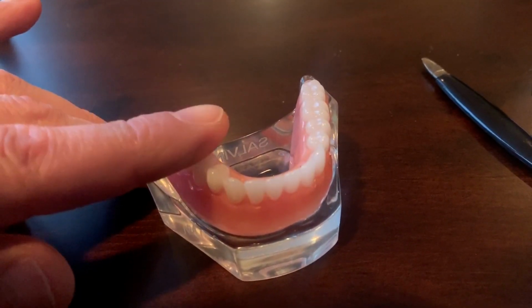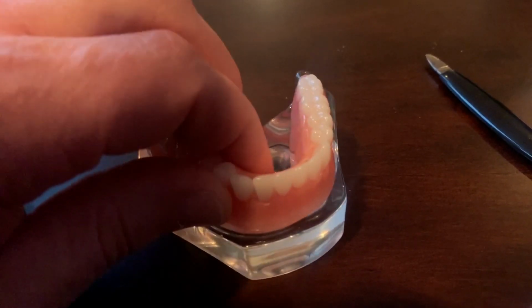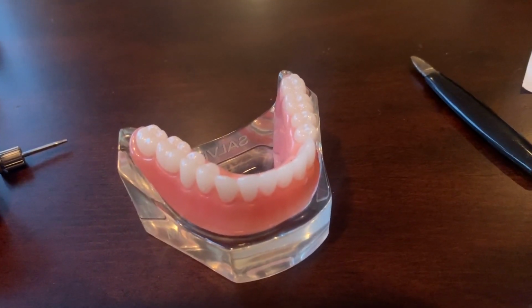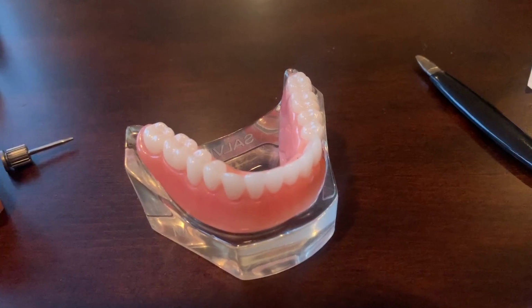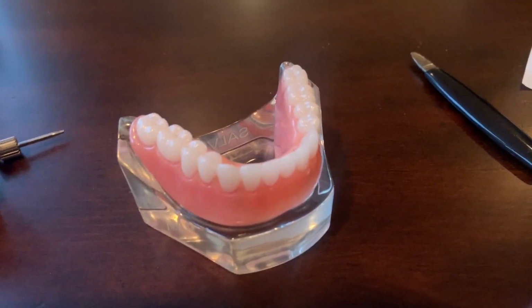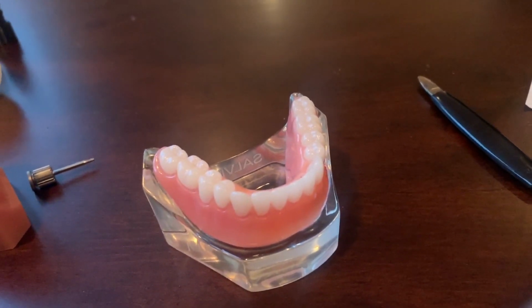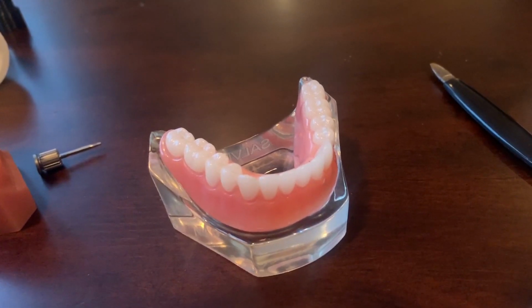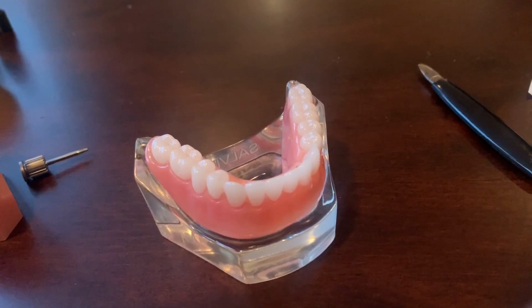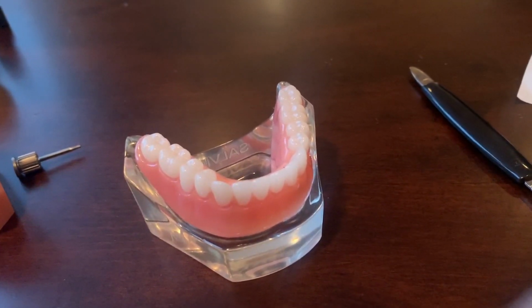People obviously don't like these as much because they do come in and out of the mouth, but I will tell you they're quite stable. Once they're snapped on to the abutments, these teeth stay in there. So for people who really don't enjoy the removability and the instability of some of the old school dentures, this can really satisfy their requirements. For people that have been wearing unstable dentures to get these implants that secure their dentures, this can be a real life changer.